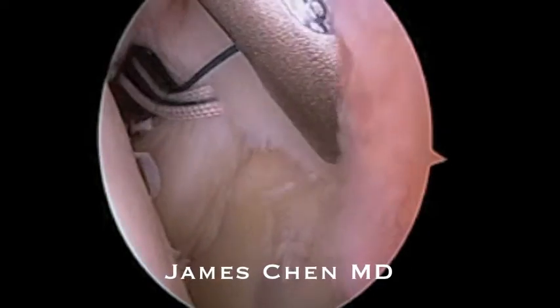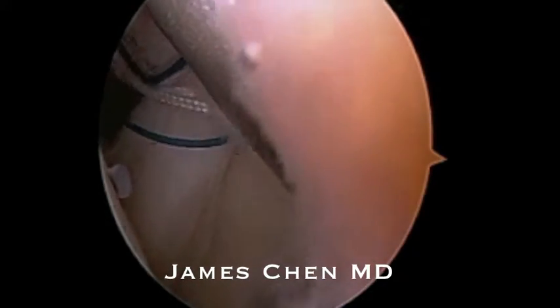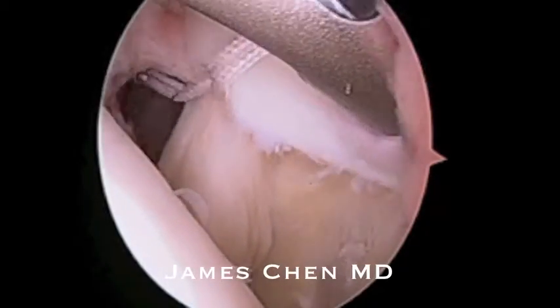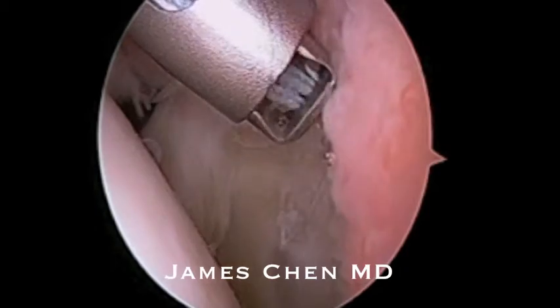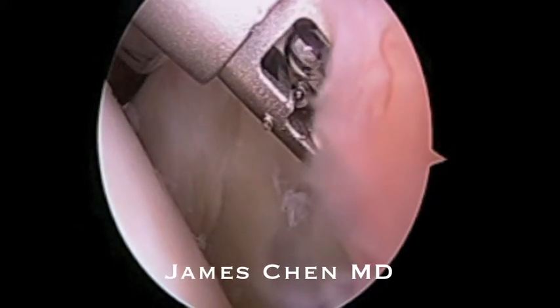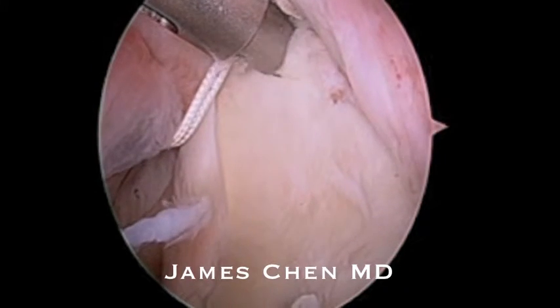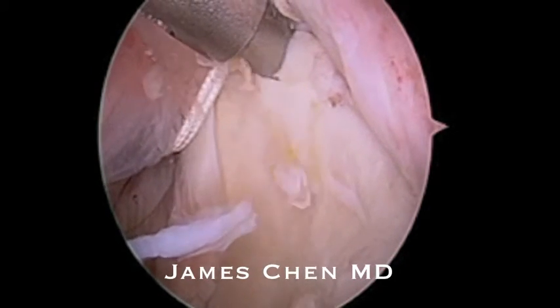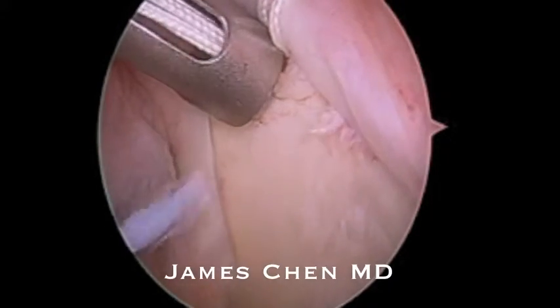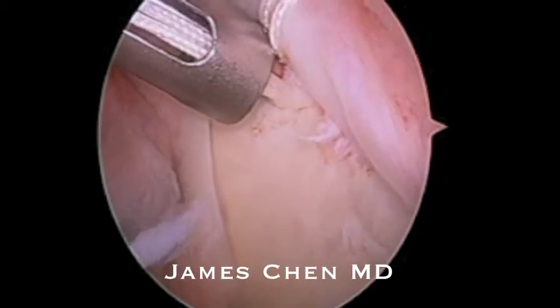I am now passing another suture through the anterior labrum and now I am cutting the posterior suture. Here I am drilling the anterior pilot hole. I have passed the suture through the anchor and am malleting the anchor in.